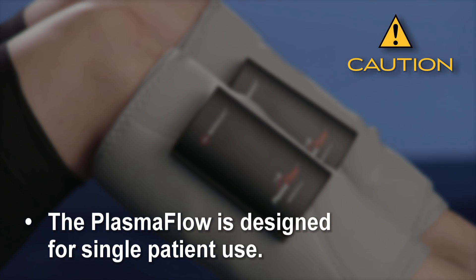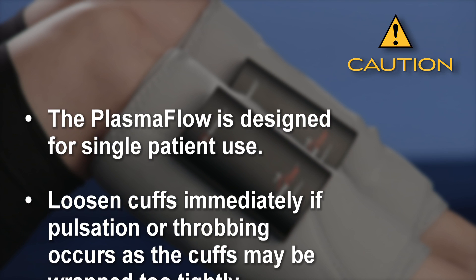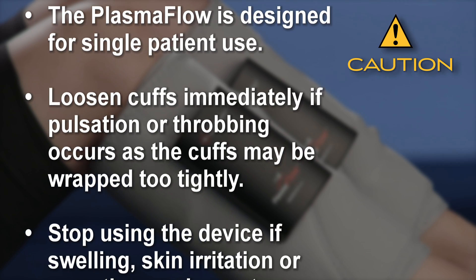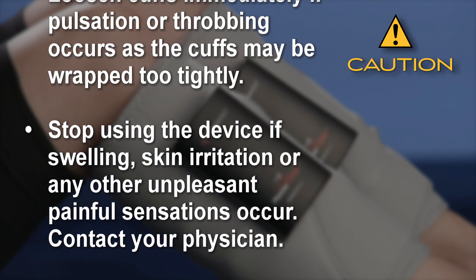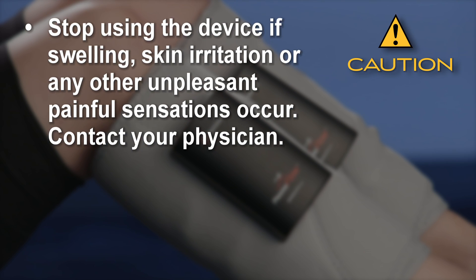The PlasmaFlow is designed for single patient use. Loosen cuffs immediately if pulsation or throbbing occurs, as the cuffs may be wrapped too tightly. Stop using the device if swelling, skin irritation, or any other unpleasant or painful sensations occur. Contact your physician.